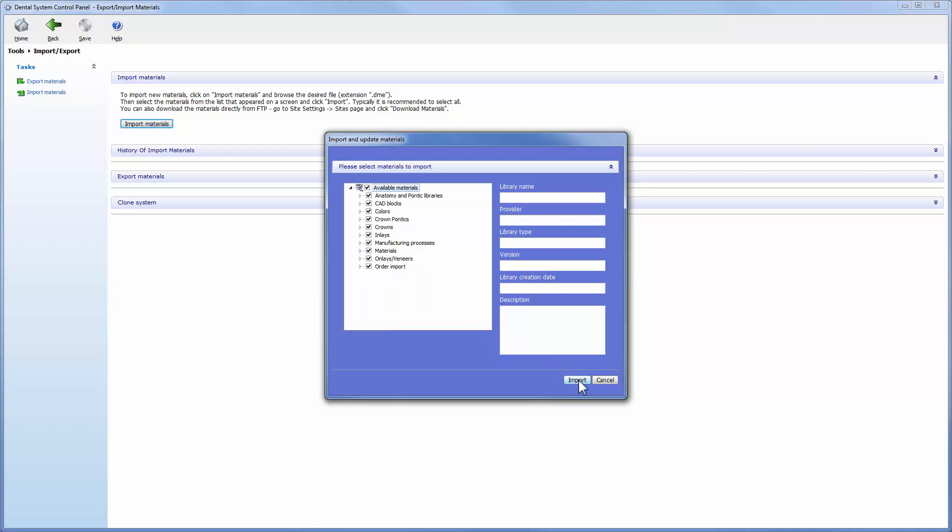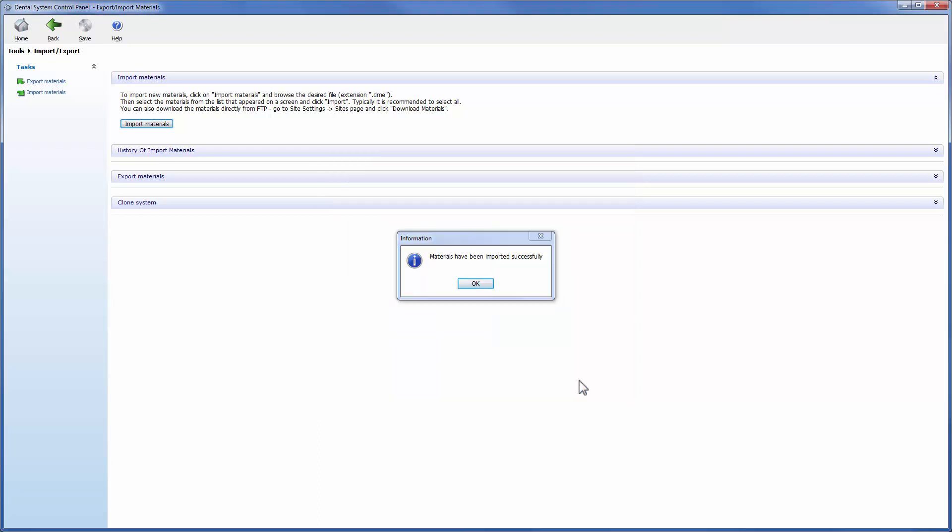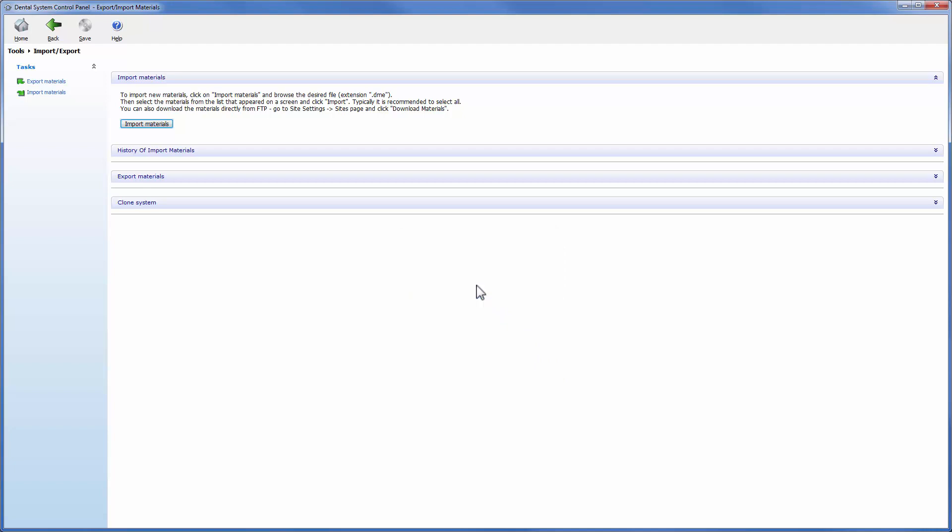Confirm your choice by clicking the import button. After the materials have been imported successfully, this information window will appear. Click OK to continue.